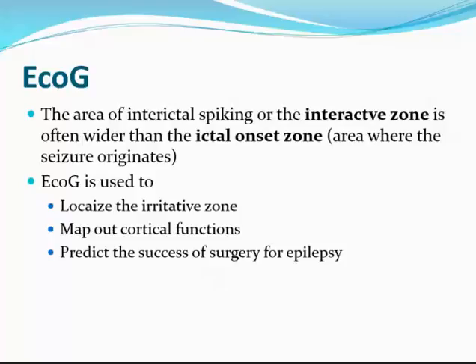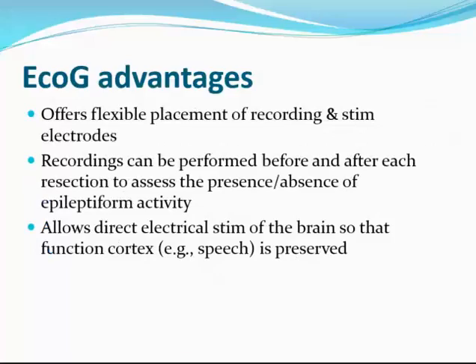So the area of interictal spiking, or the irritative zone, is often wider than the ictal zone, the onset zone, where the seizure originates. So ECOG is used to localize the irritative zone, to map out cortical functions, to predict the success of surgery for epilepsy. The advantages of ECOG: it offers flexible placement of recording and stimulating electrodes.